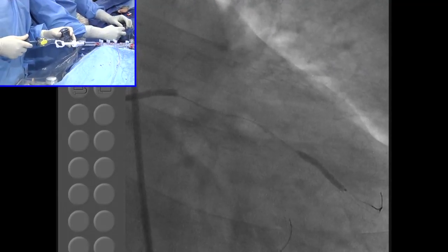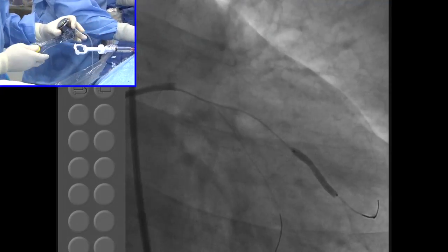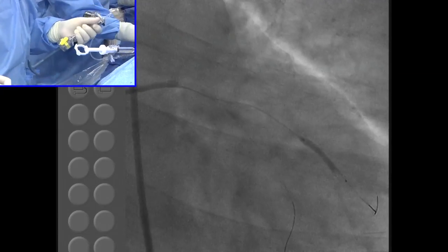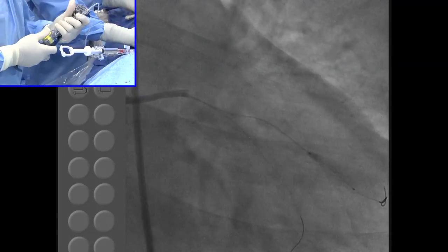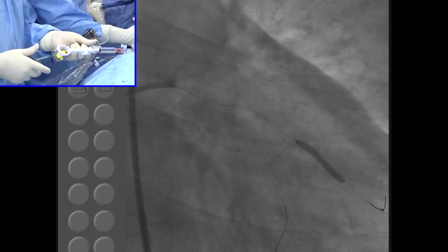You're going to post. See now? Right, even the 2.5. This should be 12, 14, we can always post dilate here. 14. Now question. Okay, now you get the chocolate balloon.